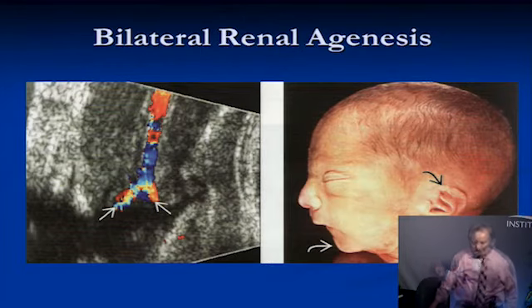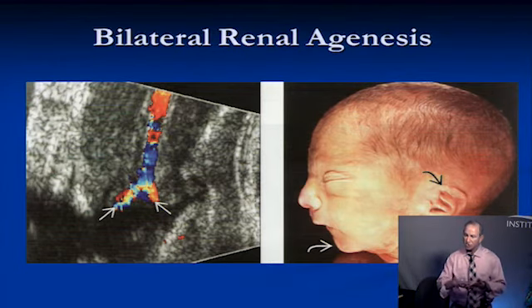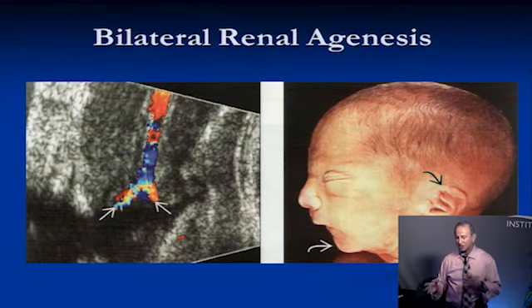So she comes in, you scan her, there is no fluid, no amniotic fluid. So the first thing you ask, okay, did you have any leakage? I'm not sure, I feel wet sometimes. But did you have gushes of water coming out? No, I don't. So that's probably not ruptured membrane.